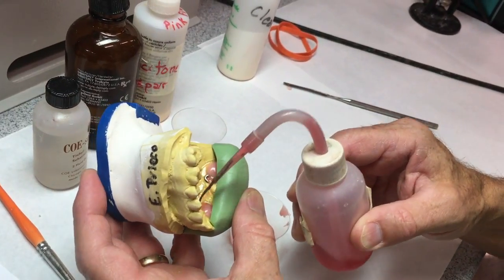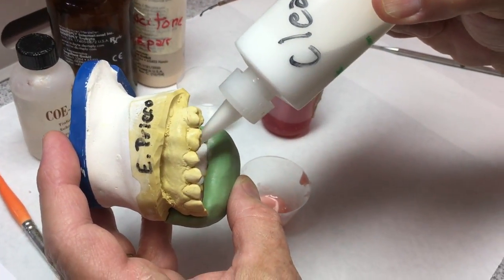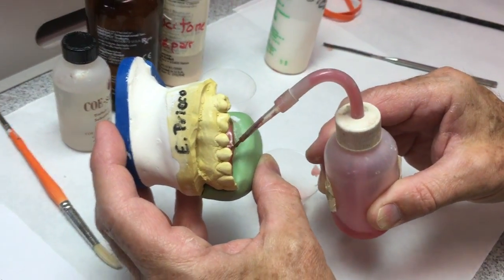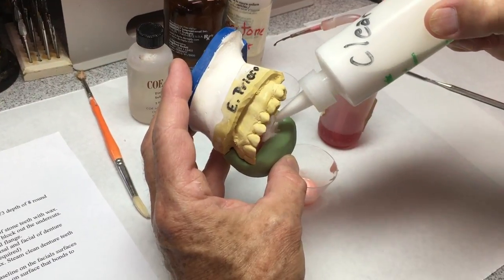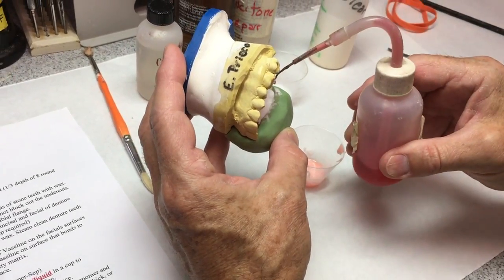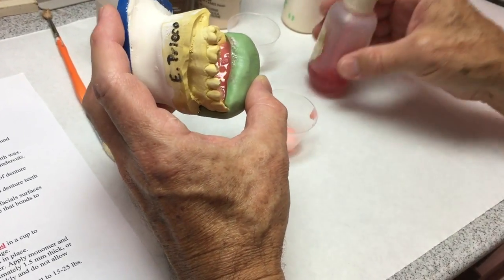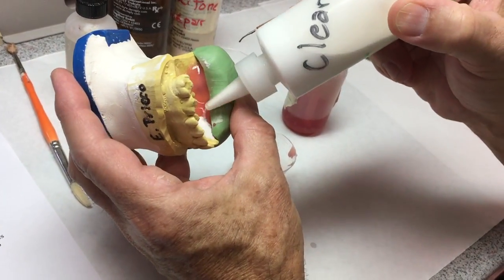I'm going to use pink liquid — wet the cast, sprinkle with clear polymer powder. Ultimately I want this to be about a millimeter and a half thick, as uniform as we can make it. When I can't quite see the yellow cast through the acrylic, I know I'm just about right. This matrix is trimmed and cut so I have access from the lingual. The buccal side was festooned in wax, so the acrylic is formed to my festooning. On the lingual, we just keep applying liquid and powder until we get the right thickness.